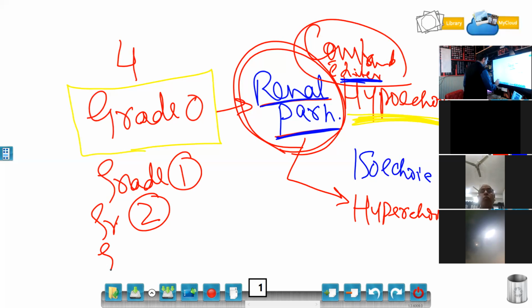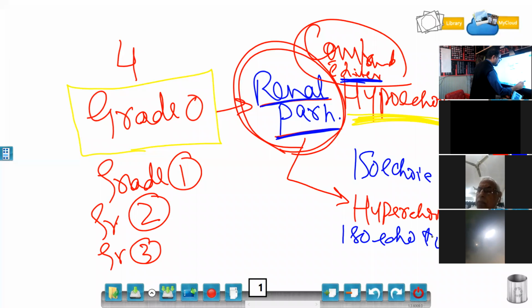Now grade third. Grade third will be when it is isoechoic to renal sinus.